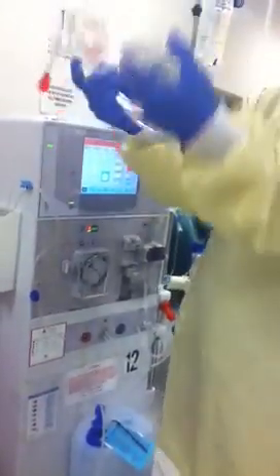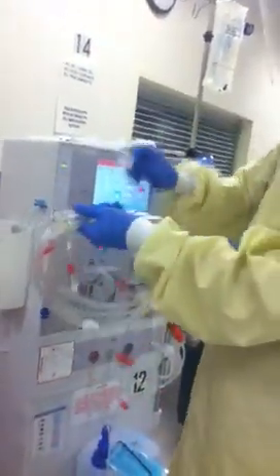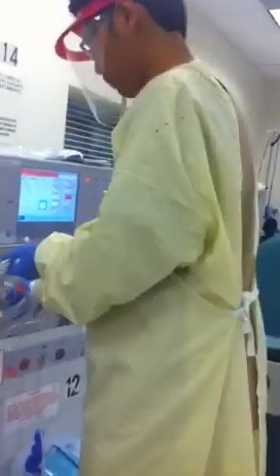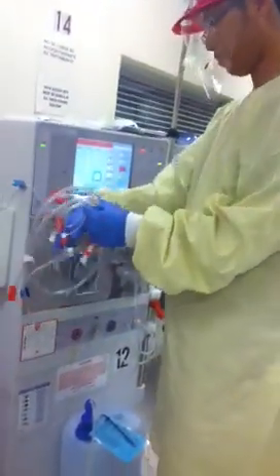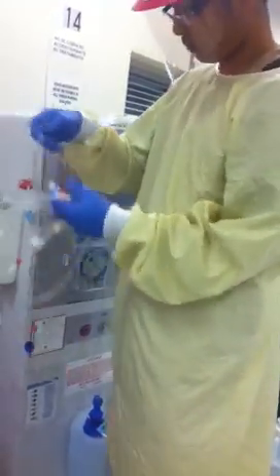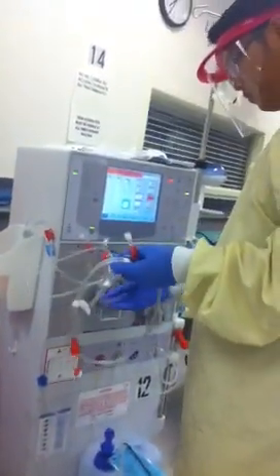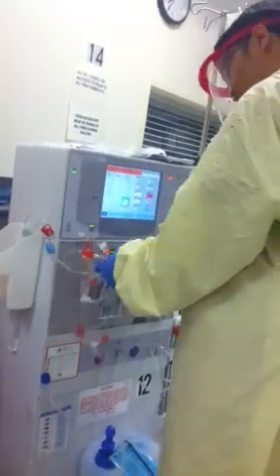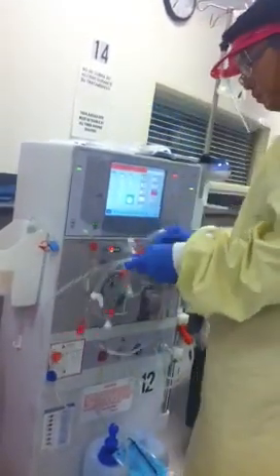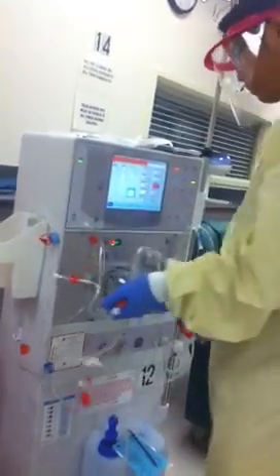Now we're going to connect the arterial line. Goes here. Again, this line goes to the bucket to the patient. And this fat one will go into the blood pump.